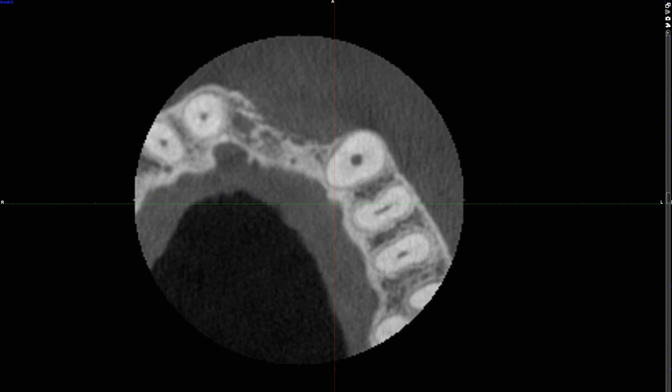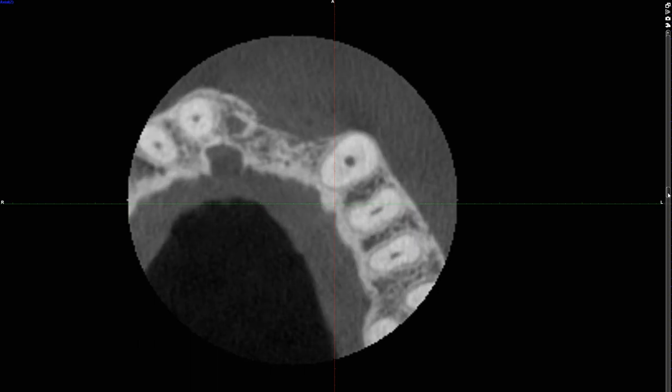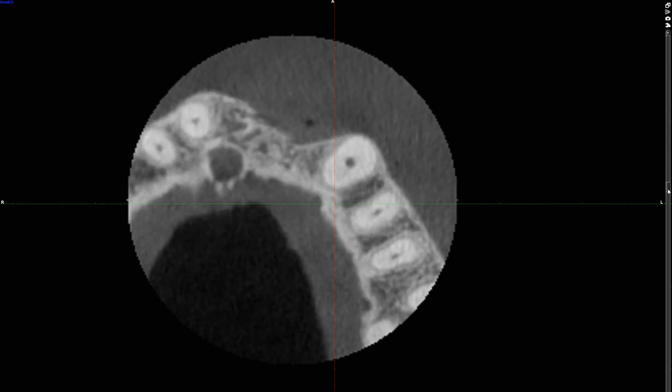Another question you can ask yourself is: what teeth are missing? That could be a difficult question. If you haven't seen CBCT previously, in order to determine which teeth are missing, you have to have some anatomic features to help you orient yourself. From this particular view, the best anatomic feature I'm going to suggest to identify is the nasal palatine canal. Where is it? Ask yourself that question.